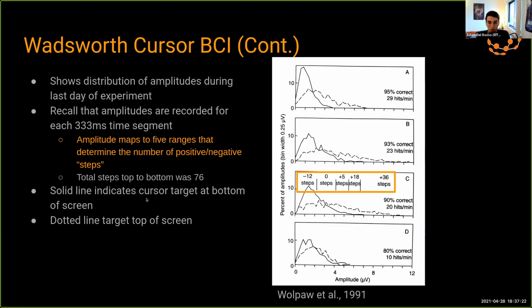So, yep, okay, I think that's it for that. And this is really what the BCI that I'm going to show is trying to replicate. But in my case, I mean, it's 30 years later, but I'm using significantly cheaper hardware and something that you can buy off the shelf and have very quickly. And it's a completely dry system, so you're not using electrode paste and getting gunk in your hair, if you will.